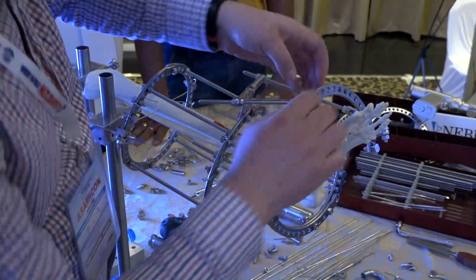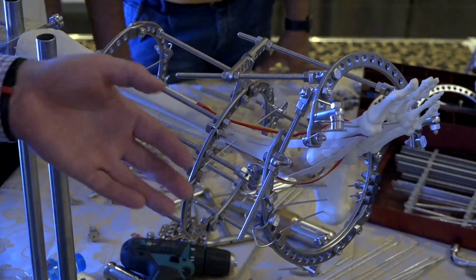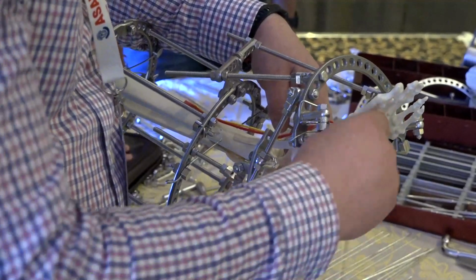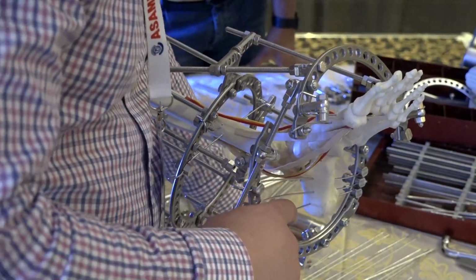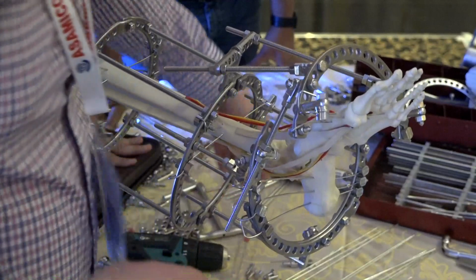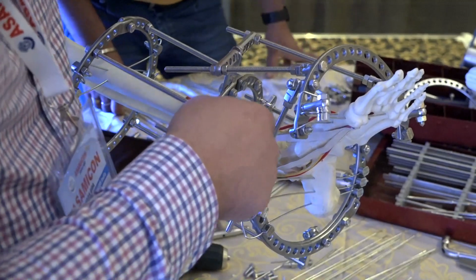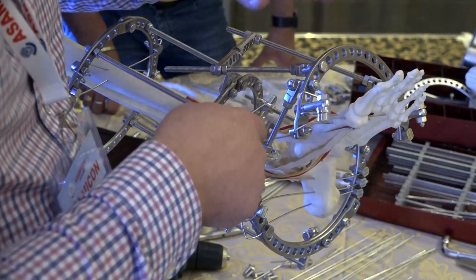So, finally, in this surgery, we make all preparation for gradual correction of the foot and ankle deformity. Sometimes if we see that the ankle joint position and position of the talus is normal, for protection of dislocation of the talus, we put one more wire and fix that wire on the distal ring, on the tibia. It's very important for protection of the ankle joint and for protection of dislocation of the talus in cases where the talus position is normal.